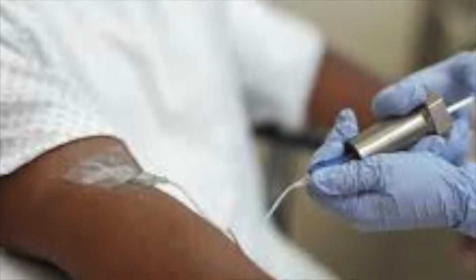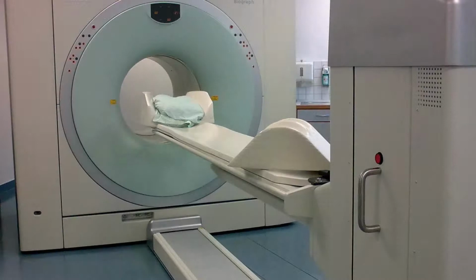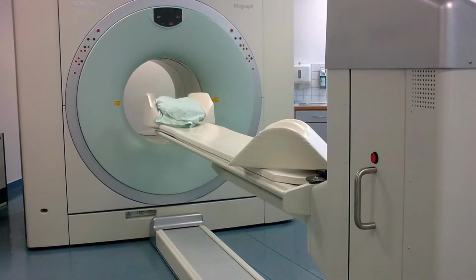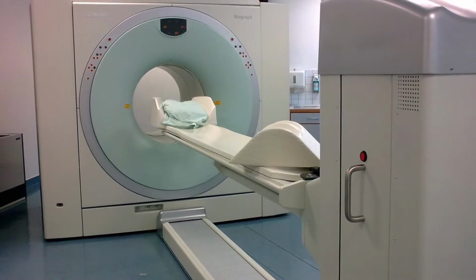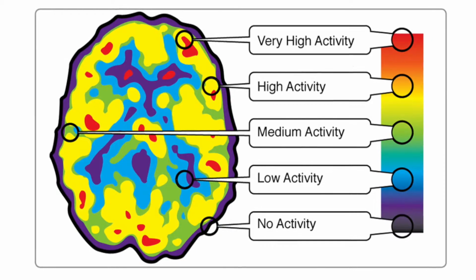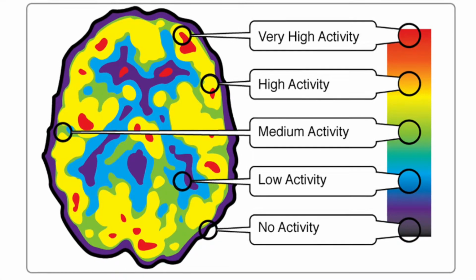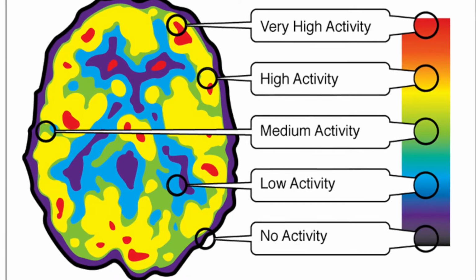Radioactive tracers are administered to a patient through an intravenous injection into the vein. When the scanner begins to move, it detects radiation of gamma rays emitted by the positrons due to the breakdown of the radionuclide. After that, the computer analyzes these gamma rays to create brightly lit images of the tissues within the organ. The amount of radionuclide collected in the tissue affects how brightly the tissue appears on the image.